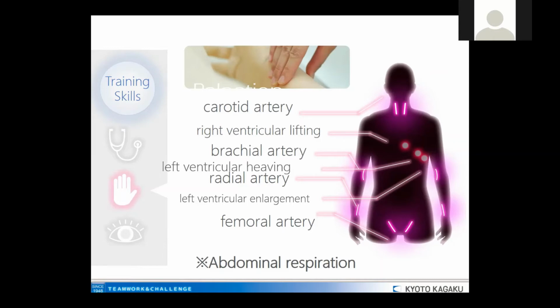And if the students are not able to understand both of them at the same time, there is not a real learning about what is going on inside the heart. So all those simulators that are not able to palpate the pulse, they are not really providing a good understanding about a heart examination. So this is also a very important point. Sound and pulse together, to hear and feel with the palpation.